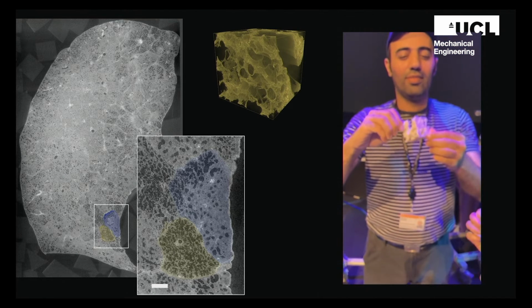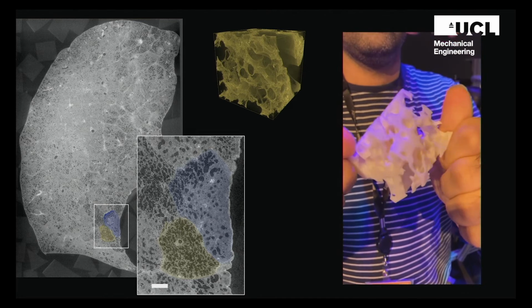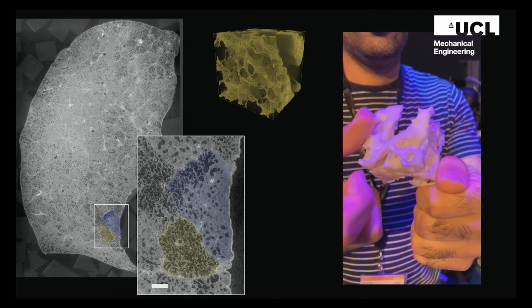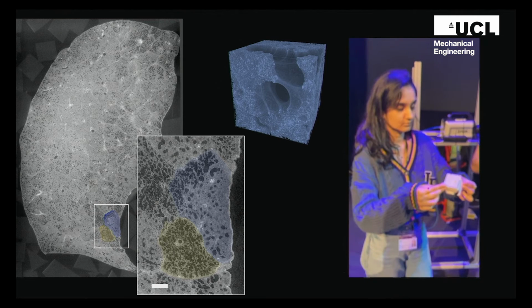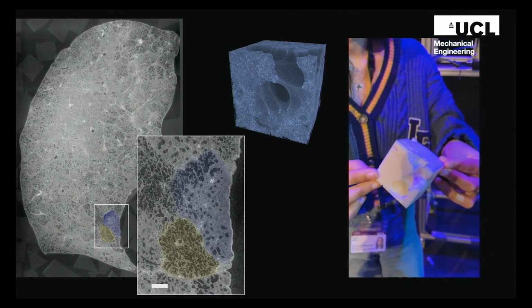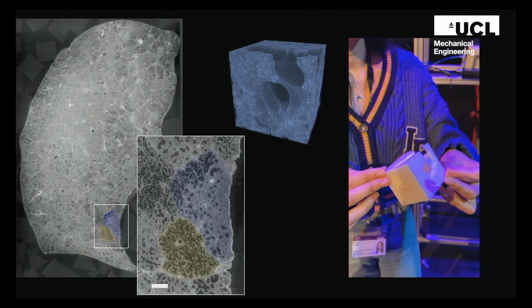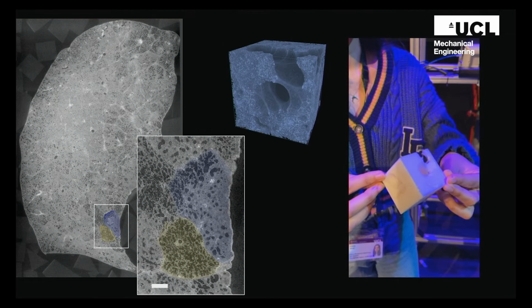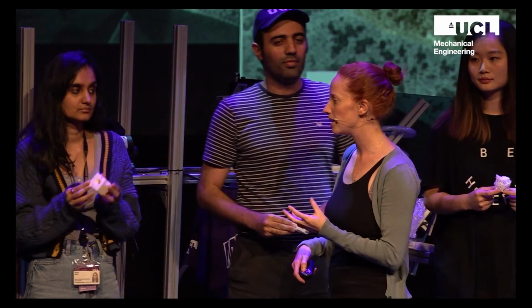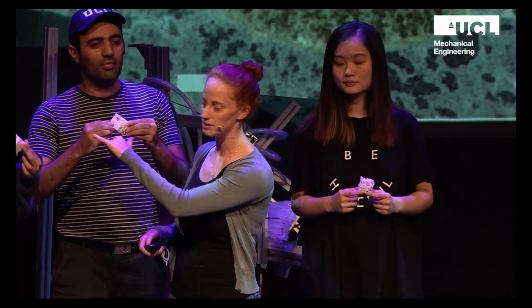Now, this part of the lung has been damaged by COVID, but it's still sort of functional. You can see there's some open air spaces in here that could exchange oxygen with the blood. Finally, if I go across to my colleague Alicia, she sadly has the blue area of that lung up there. This is an incredibly damaged part. There's almost no open air spaces left at all. There's a few larger kind of ducts here, but these don't exchange oxygen with the blood, and these would be completely non-functioning.